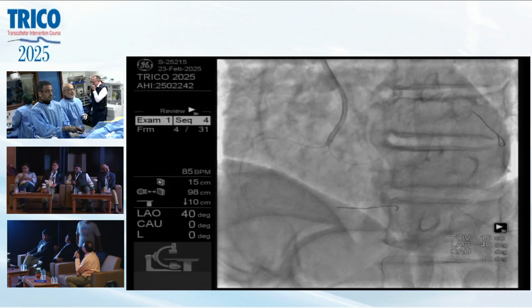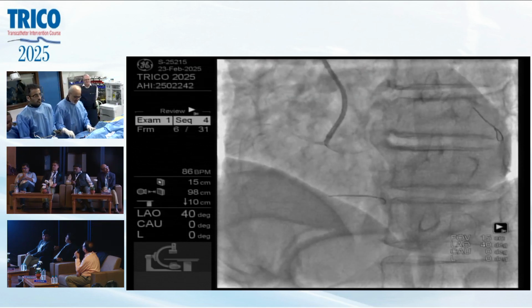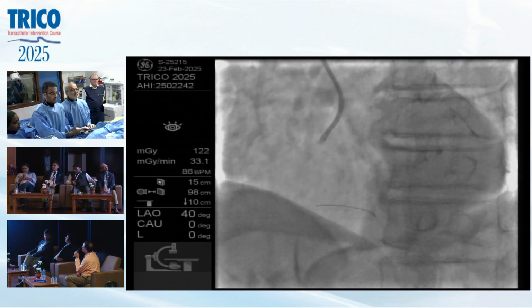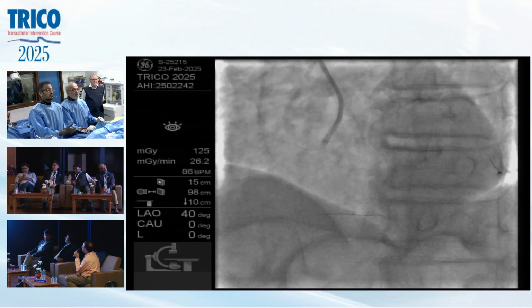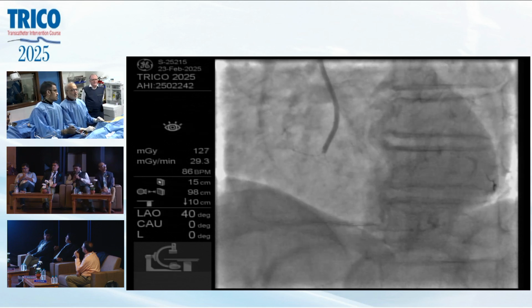How many of you think the lesion is pretty long? Let me simply go in a little deeper, and then take a better injection. So you're still going to do clockwise rotation? A little bit clockwise. Scout.